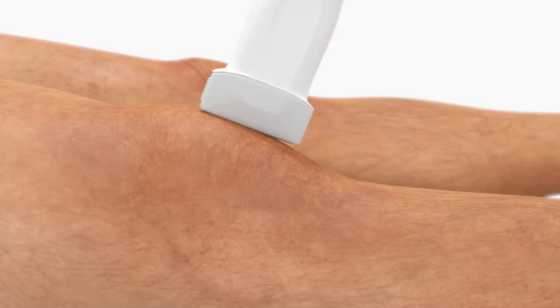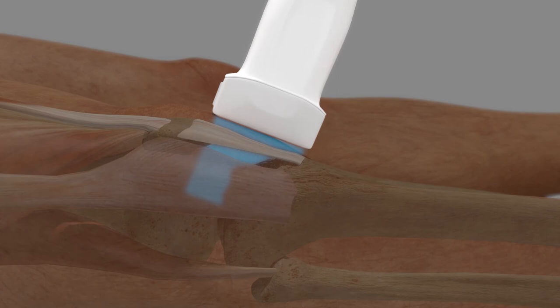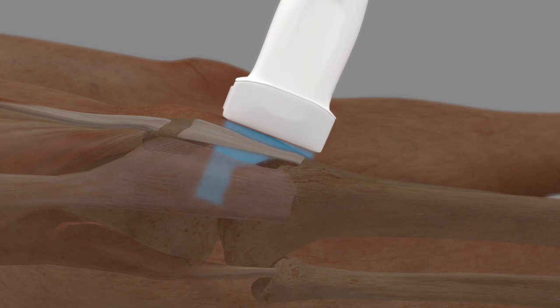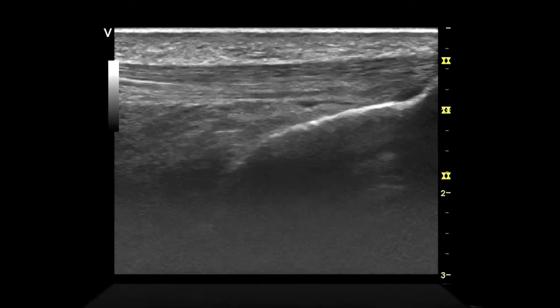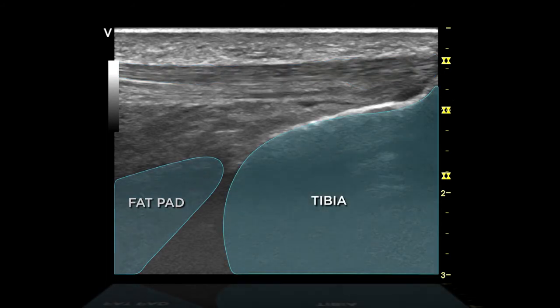With the probe marker pointed proximally, place the probe over the distal end of the patella. Track the patellar ligament to the tibia. Identify the patellar ligament, the fat pad, and the tibia.